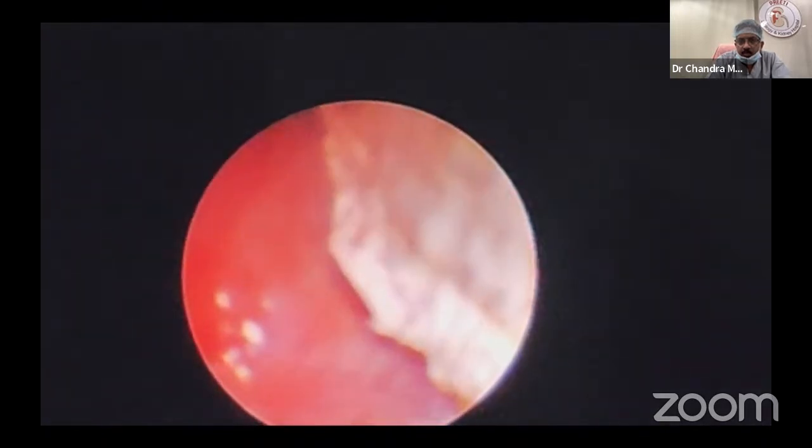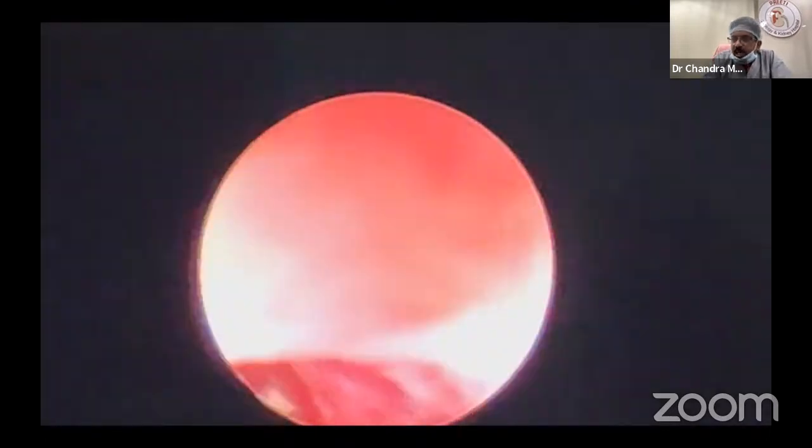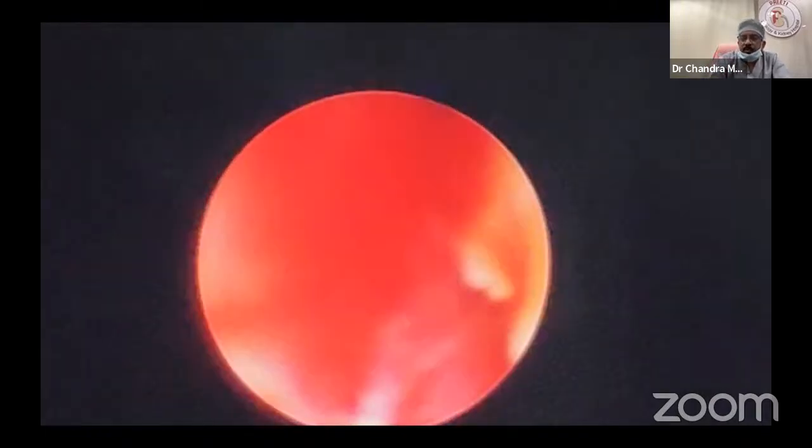This forceps is already here. This is very dangerous. I am taking a curve in the upper ureter and taking out the remaining stone. You don't know how thick it is. You should judge carefully. Use biprong or triprong, rotate slowly so that you deliver it. Never pull out in one go. What I do, you should do carefully.